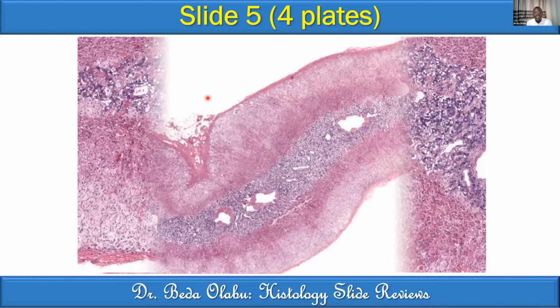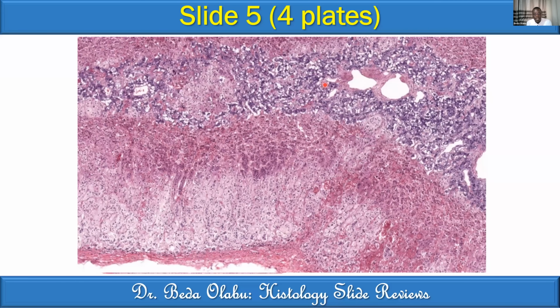In the third magnification, we confirm that the cells of the outer zone are in a cord morphology, and the cells of the inner zone are in the cluster morphology. So cord and cluster take us to endocrine gland. Confirm that the gland is still encapsulated, so that's the capsule. So yes, this is the slide of the adrenal gland.